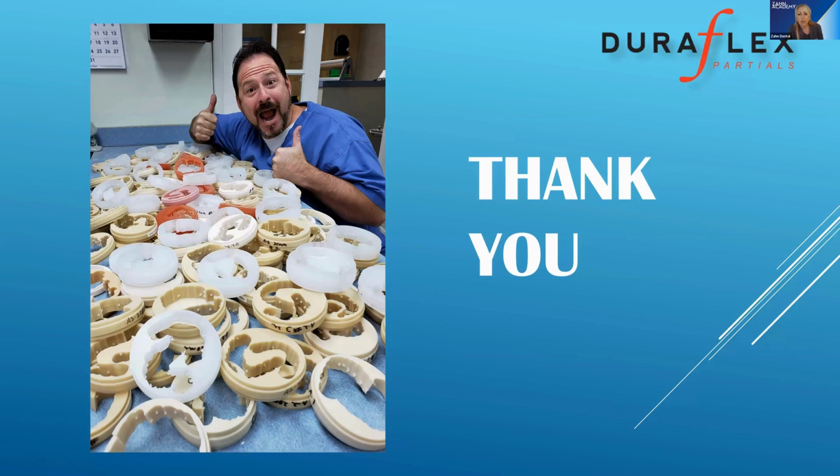So if you are a 3Shape user and you feel like you want to add Exocad, that's great. It's great having both. We have a great webinar on why having both is really beneficial. So I'll just keep that up for just another moment, and then we'll go on to the next.